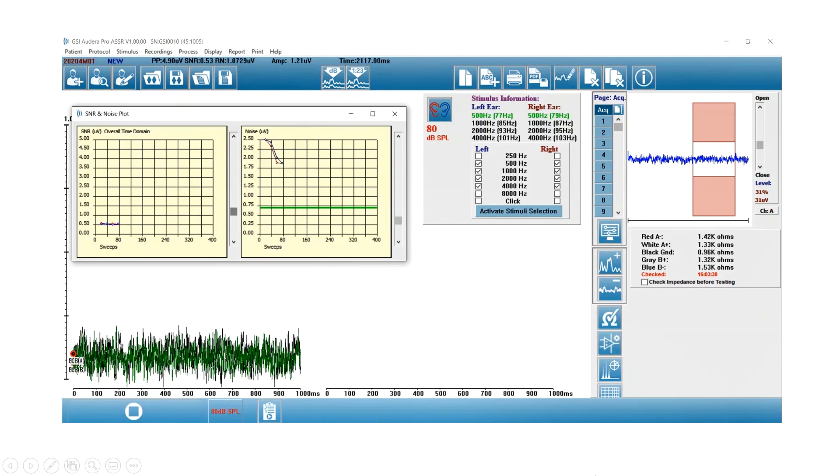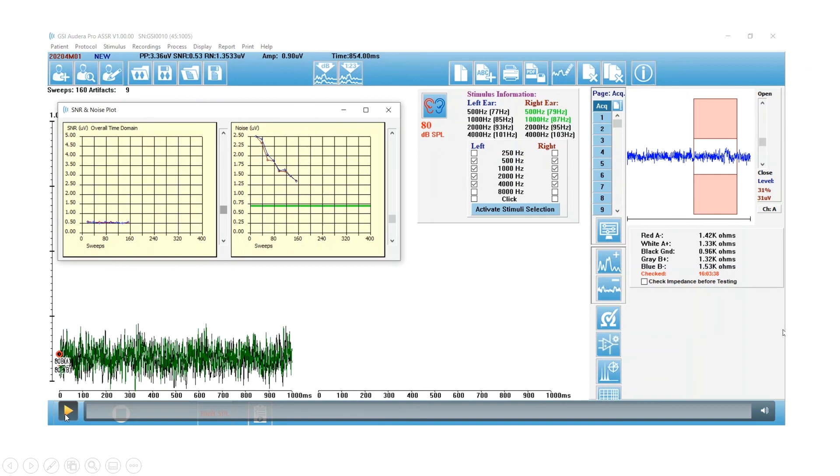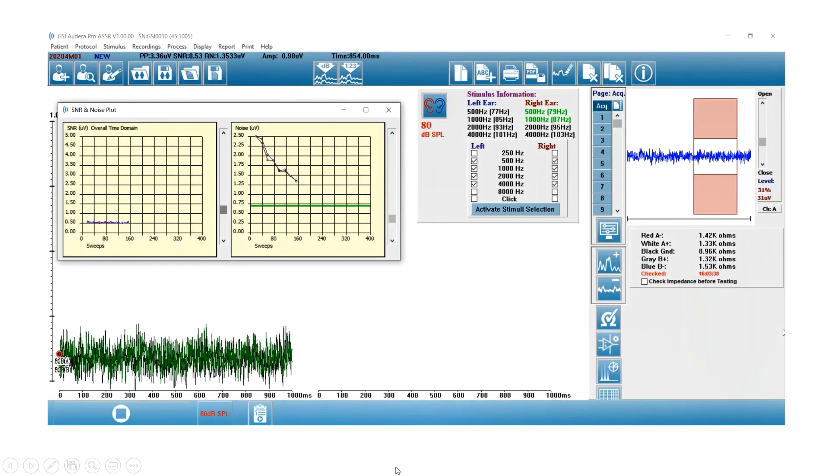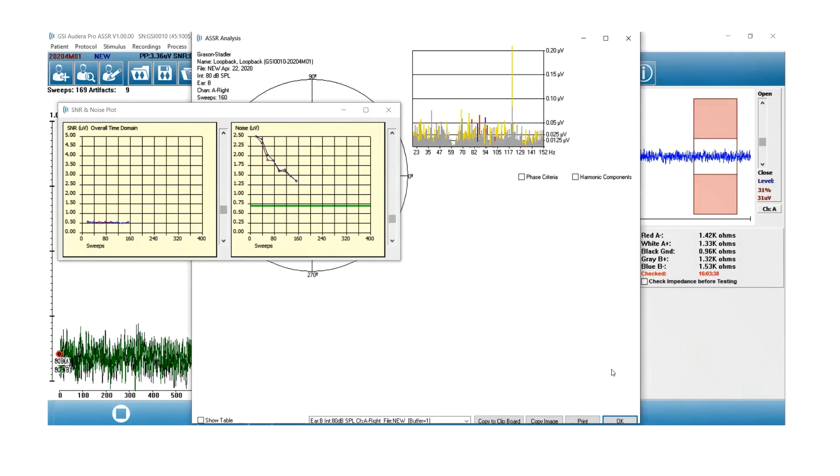Now I'm up to 160 sweeps, and I'm going to launch the polar plot window. So now I'm collecting. You can see my noise level is going down even further, and I'm going to click on that icon in the side panel.